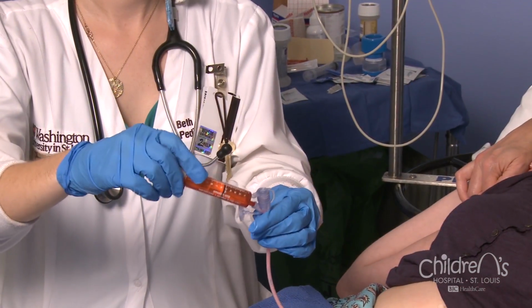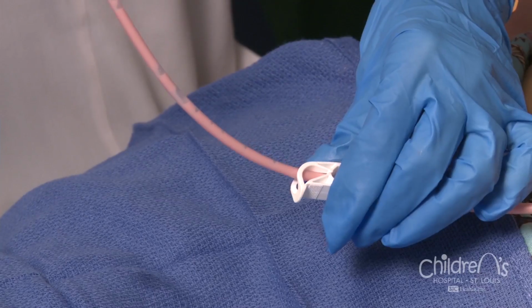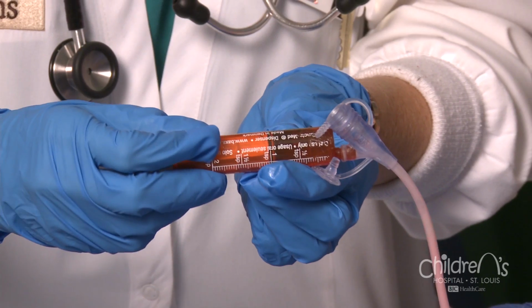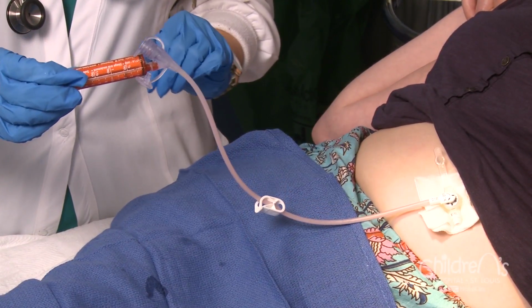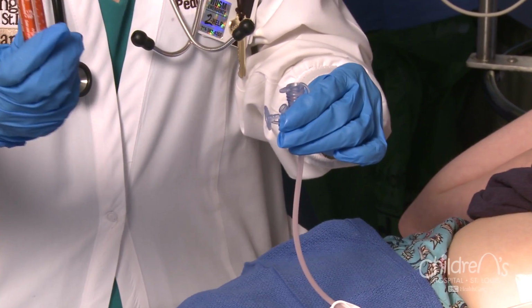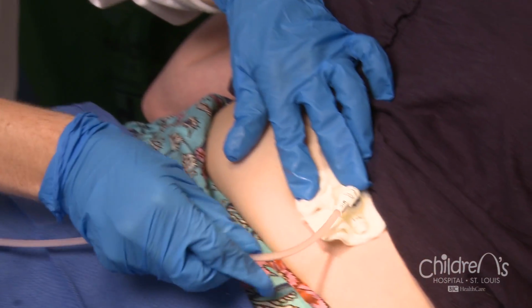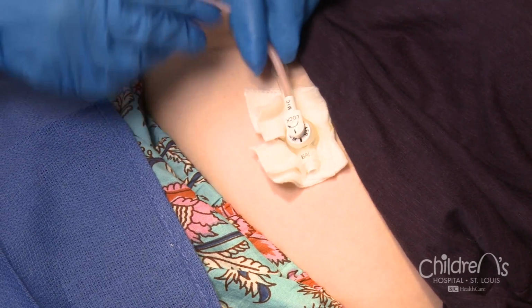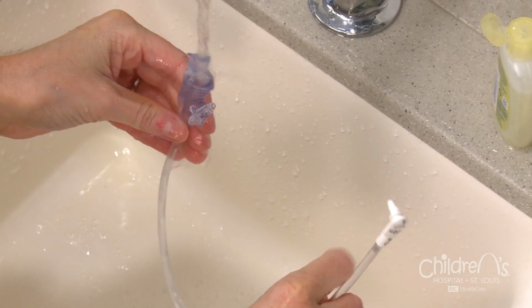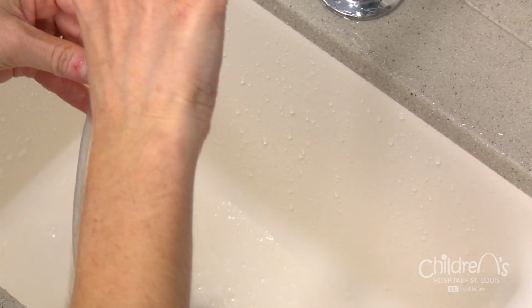Open the med port and attach the syringe with 5 to 10 milliliters of water for flush. Unclamp the extension set and push in the flush, and then clamp the extension set. Remove the syringe and close the med port. Remove the extension set and plug the button. Finally, wash the extension set with soap and water, rinse, and let air dry.